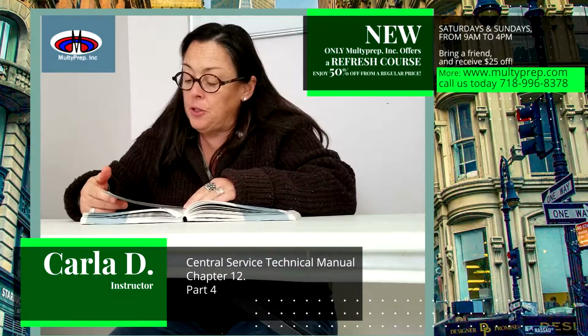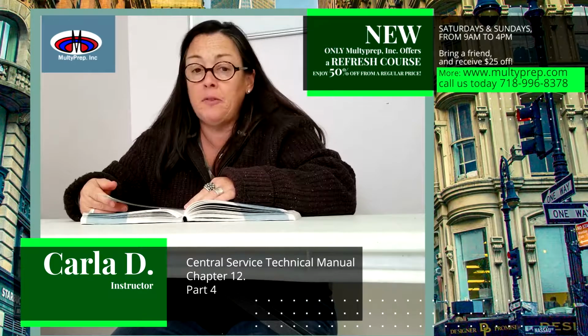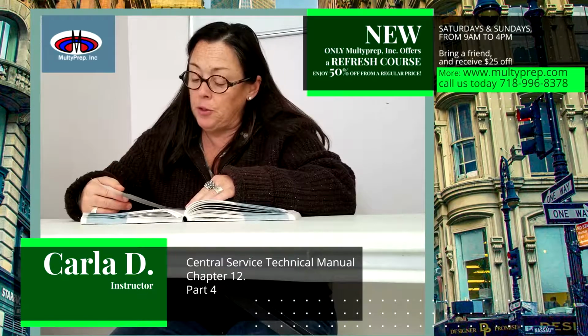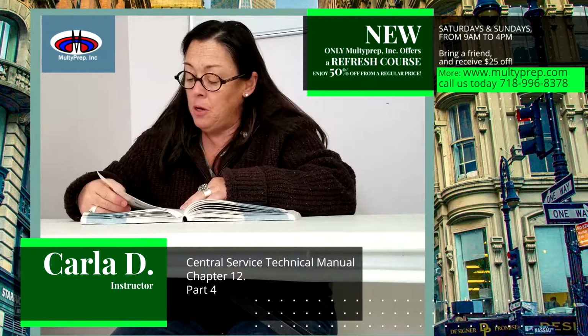Rigid containers consist of an inner basket to hold the instruments and an outer container that acts as a protective barrier. Both the inner basket and the outer container have handles for ease of carrying. See Figure 12.32, which identifies the common components of a rigid sterilization container system, outer container.